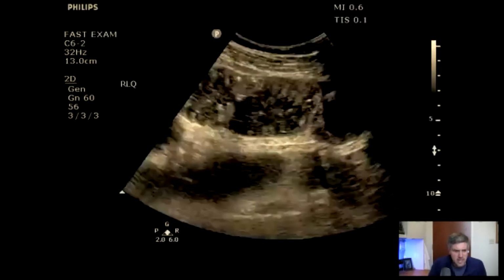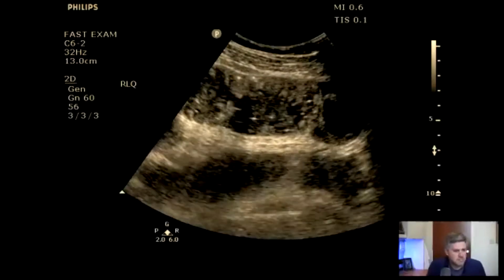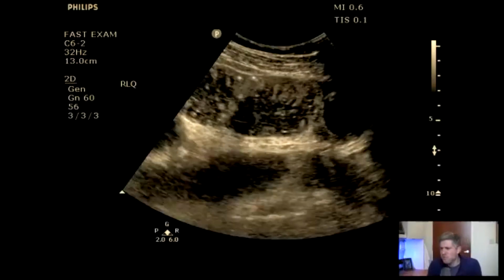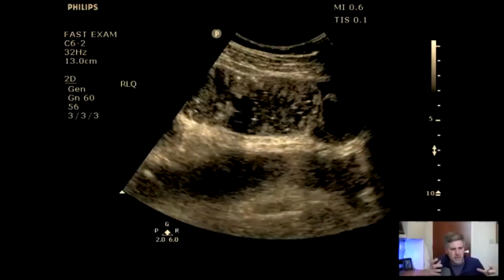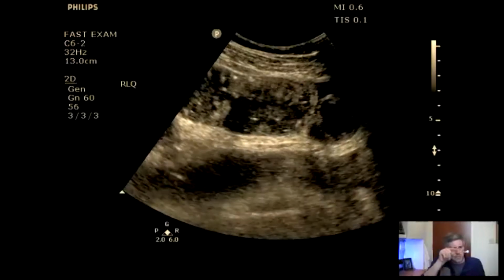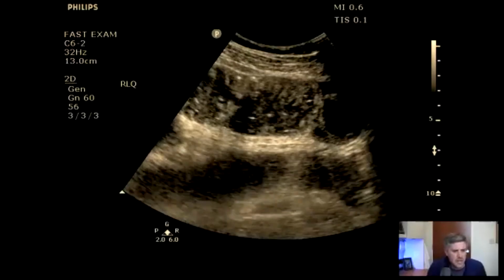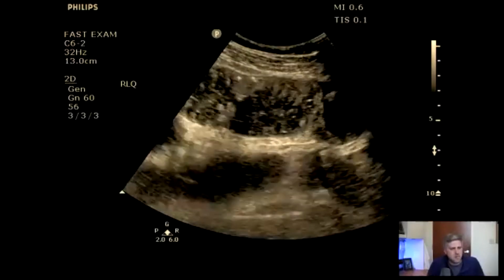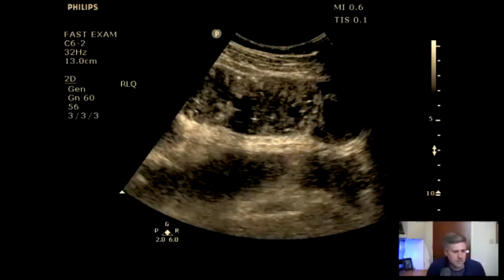And so as we scan around, we find this, right? We find something that looks a little bit more tubular than something that's rounded or cone shaped, and there's some extra things hanging from the wall and emanating from the floor of this thing. And this is an example of basically a dilated loop of bowel, right? So this patient has a bowel obstruction. They don't have a bladder outlet obstruction, right?